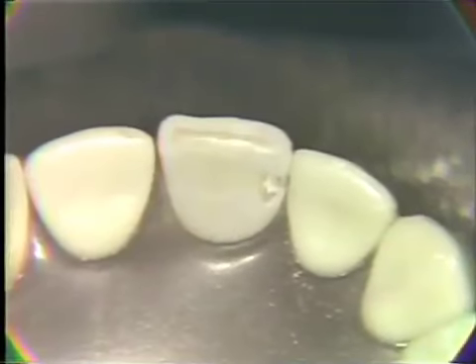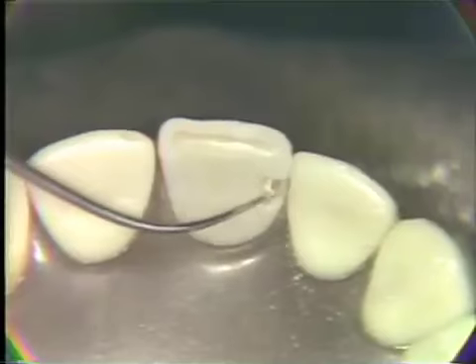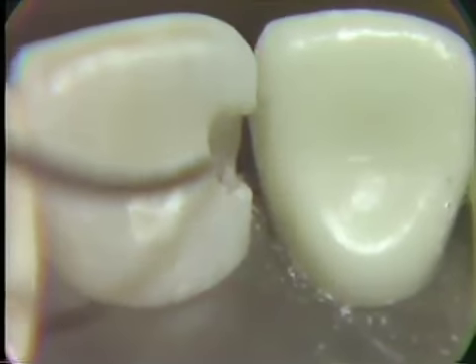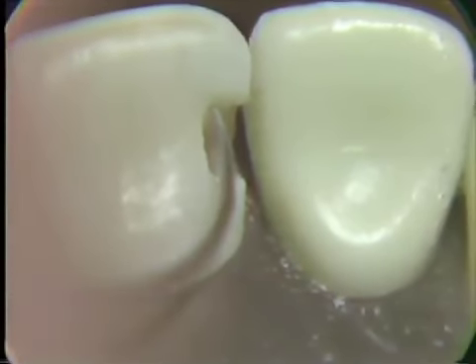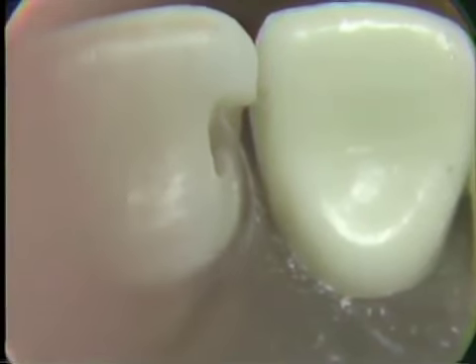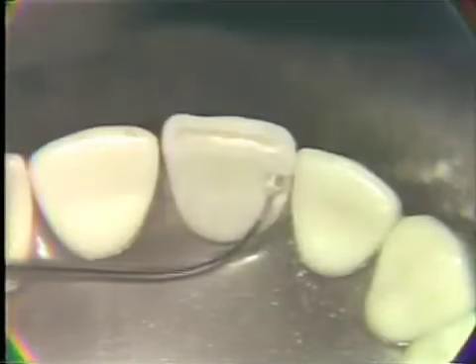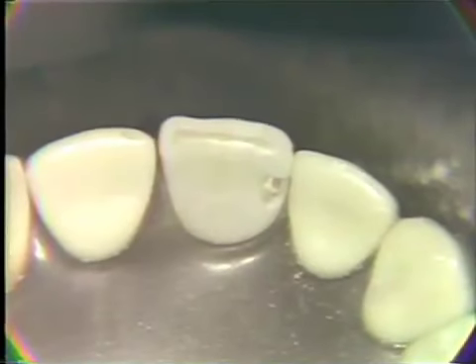We could now move into the low-speed instrumentation, and we'll be utilizing a number 1/2 burr in order to place the retention. Retention is going to be placed primarily in a lingual cervical position within dentin, and also into a labial incisal position. Be into creating a point angle in this incisal area. Third point of retention, which will be minor, will be in the labial cervical area. So we'll move then to the low-speed instrumentation.